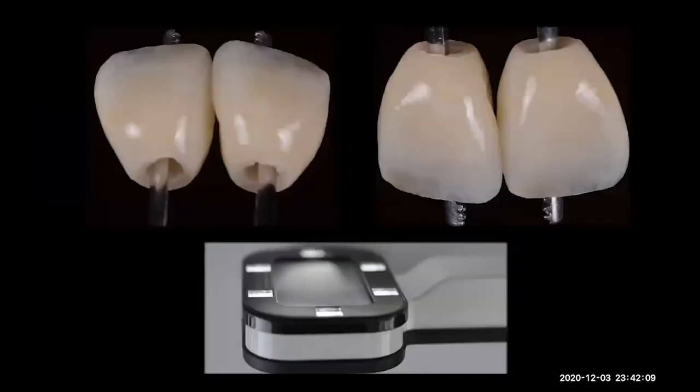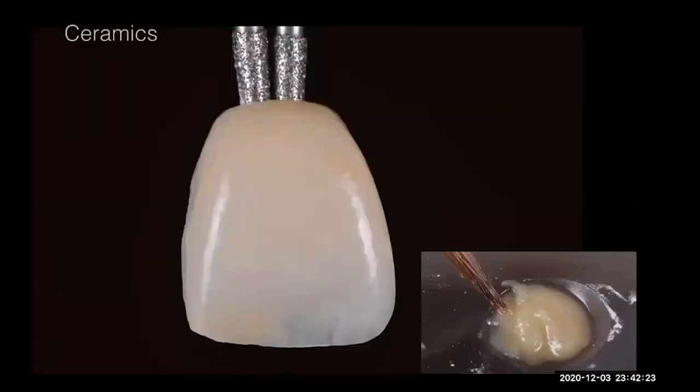This is our stain technique. We control with our polarized camera from a smile line. We calibrate the polarized effects that it gives me in the picture, and then we start using some coloring. This tooth has a special characteristic from palatal, so we use the material from Sasha Hein, where you mix the liquid with the ceramic and you can see the real color in the ceramic. We use that technique too, and you can see here in the incisal edge of the central, the yellow color.